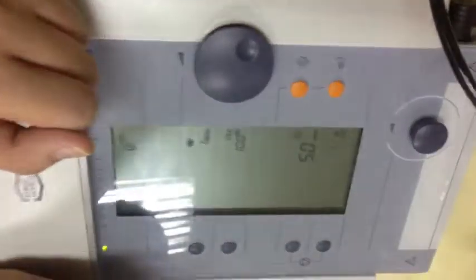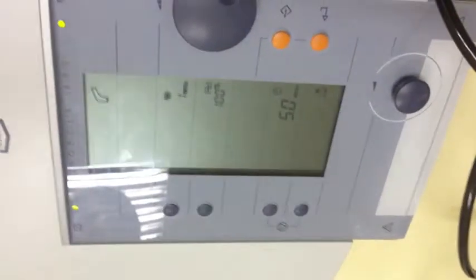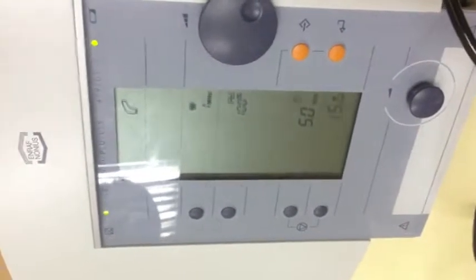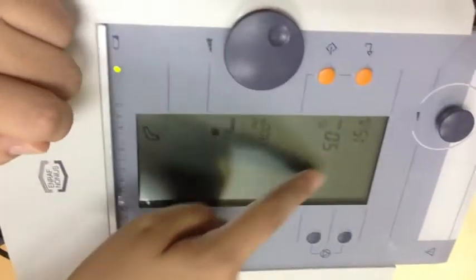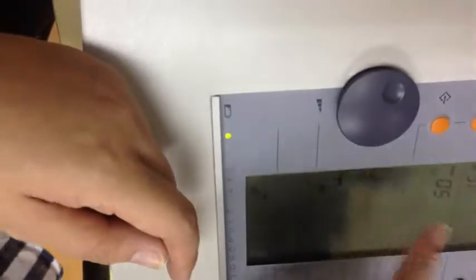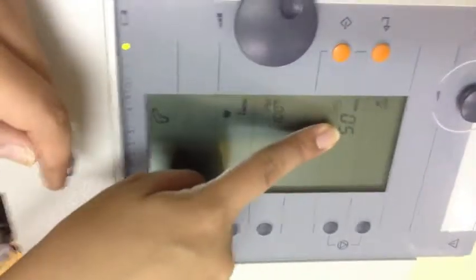So our clinical application usually lasts for just 5 minutes per area. Okay? So kung bilateral low back yan, so 5 minutes on the right, 5 minutes on the left. So, hindi na natin gagalawin yung time. Once kasi natapos yung time, and then na-reset yung settings, nasa 5 pa rin siya. So kung yung kabilang area naman yung ititreat mo, hindi mo na siya kailangan i-adjust.